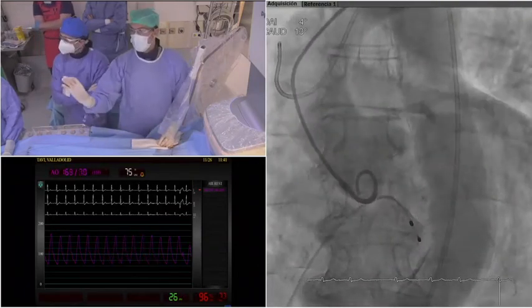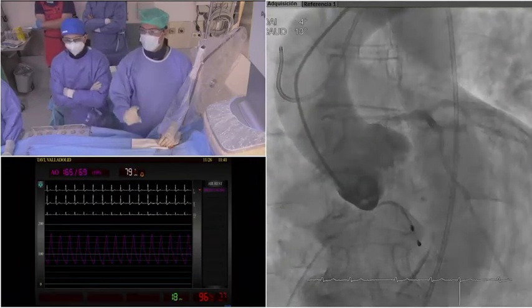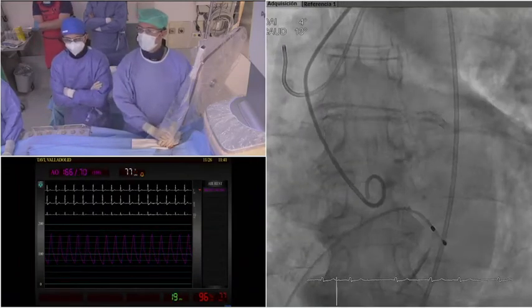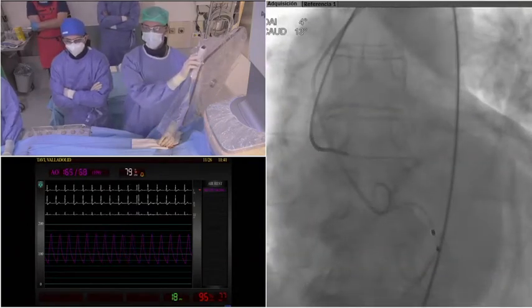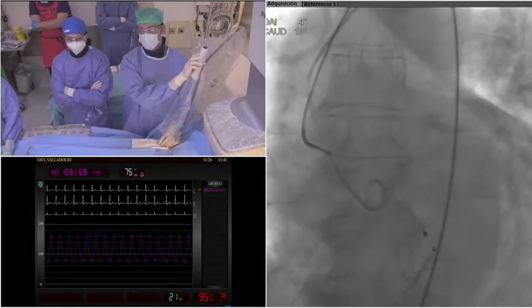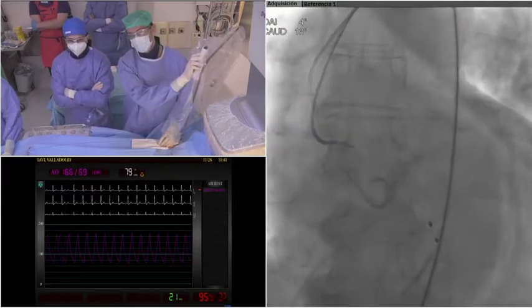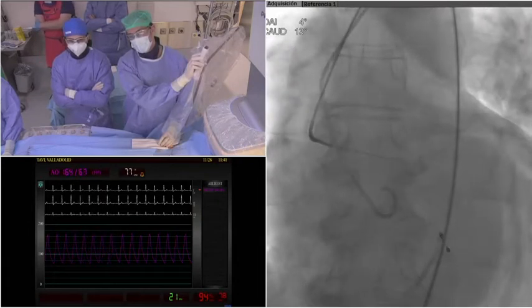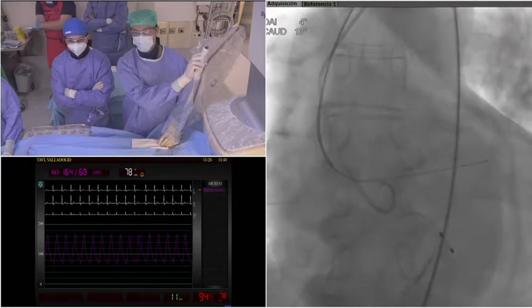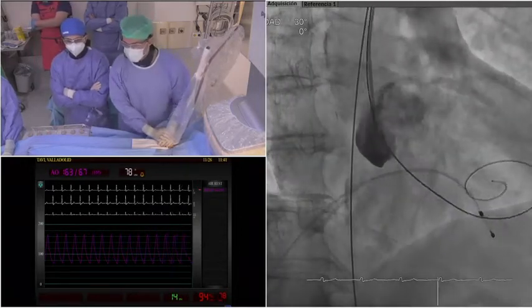We had the heart navigator. Maybe we can see it later after the procedure and see the final position of the valve according to the heart navigator in the end. But we have crossed. This is crossing the valve. It took about, I would say, 10 seconds, but probably it was a minute. And you see it's very calcified, even more than what we saw in the CT. And there it was, very eccentric, the crossing. And we have our Safari wire in place.